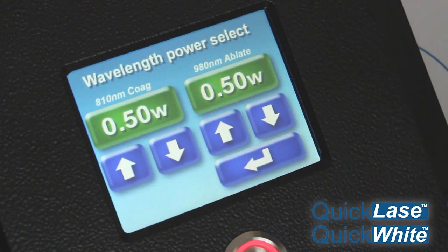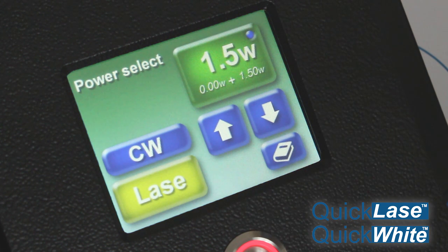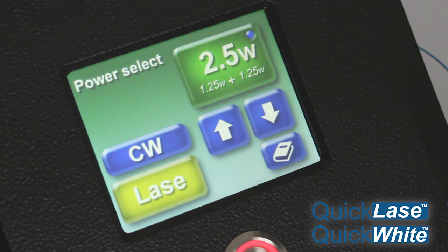The beauty of the QuickLays Dual lasers is that you can select each wavelength individually. Then press any arrow and it will automatically revert back to the 50-50 wavelength.